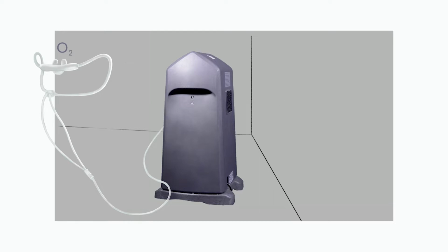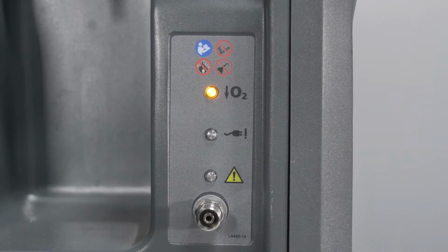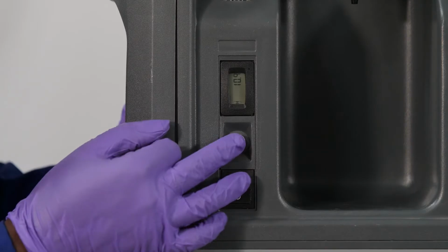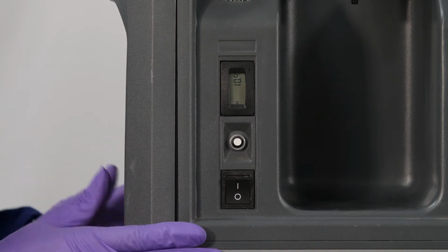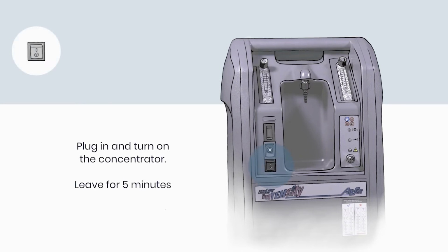If it is too close, it will not be able to get enough air to produce oxygen, in which case the low oxygen alarm may well go off. Or else the machine may overheat and the reset button will pop out, turning the machine off. Next, turn on the power switch and leave the concentrator to run for 5 minutes. It takes a bit of time for the machine to produce a high enough concentration of oxygen.